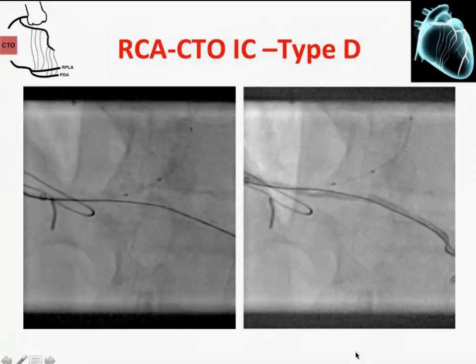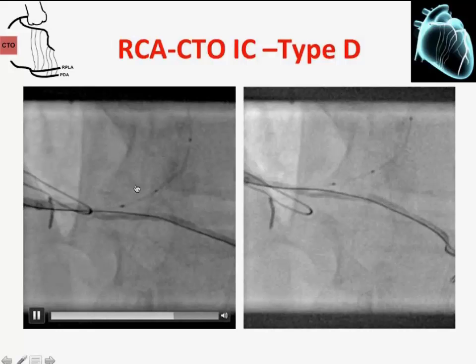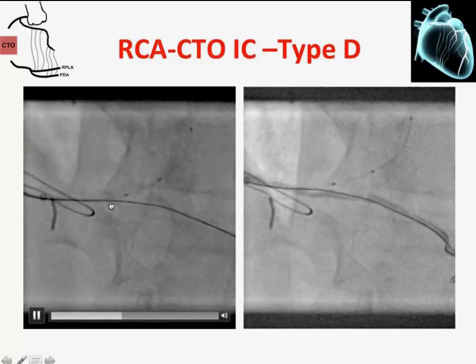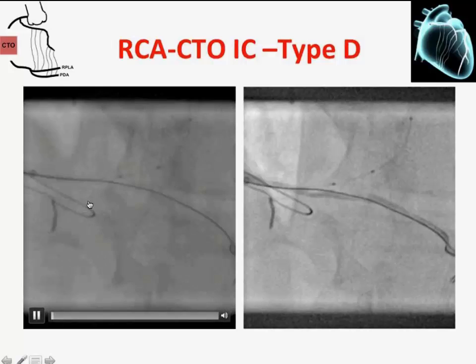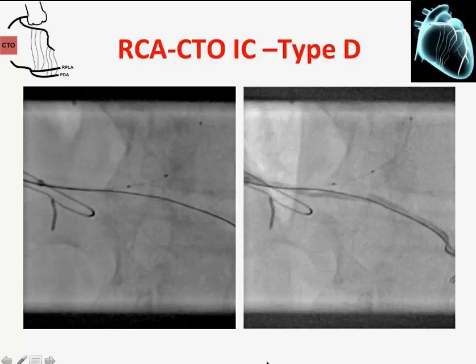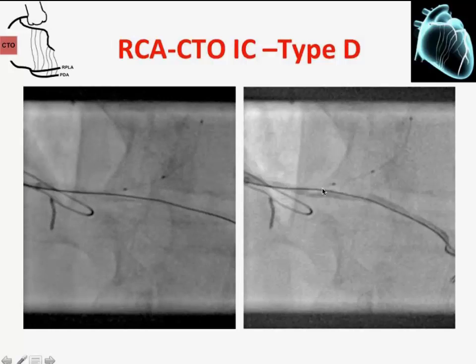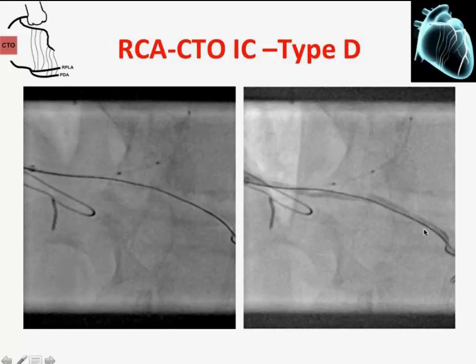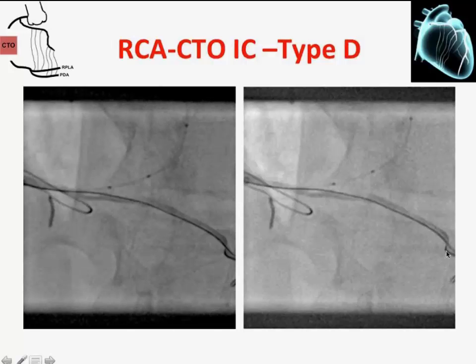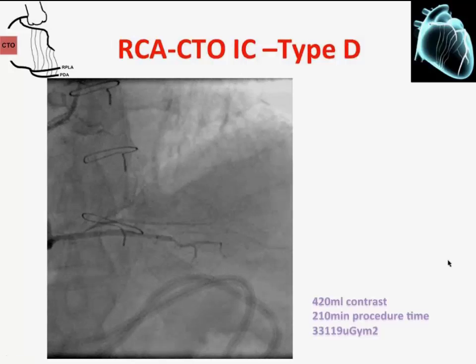So what I did here is I took a dual lumen microcatheter and a Twin-Pass, and I had one wire in subintimal space and puncture with a Fielder XTA in true lumen. So as you can see here, this was the subintimal space, and the black wire is the wire in the true lumen. And this was then after stenting the whole thing.